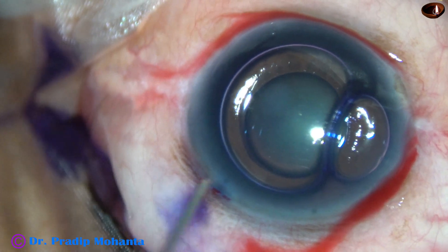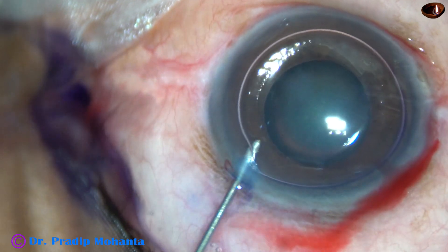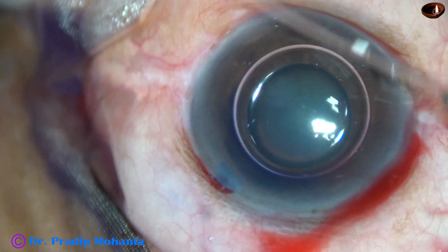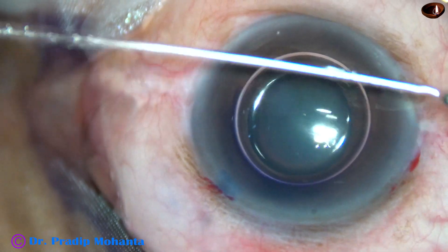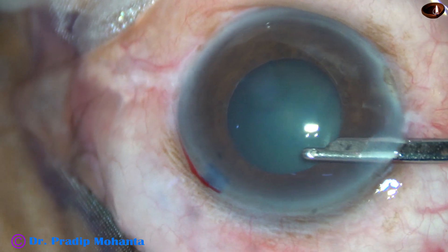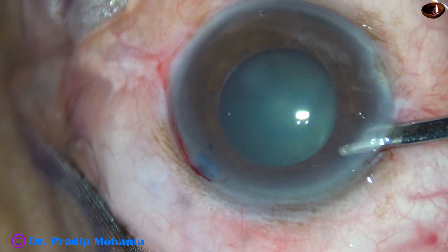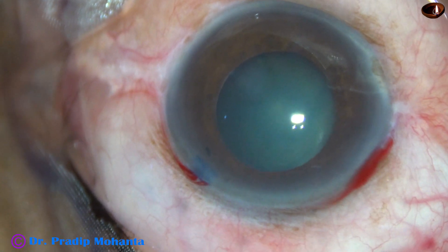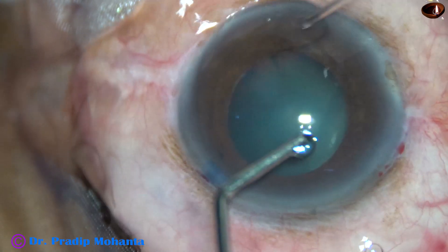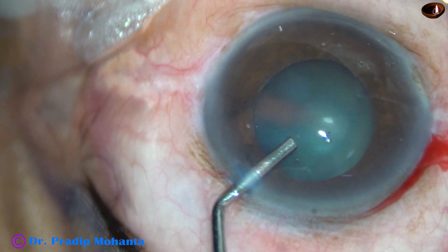In this case, I am going to use adrenaline to see if the pupil dilates a little more. Size of this pupil is about 4.5 mm, but the pupil didn't dilate — probably the size is about 5 mm. It didn't dilate with adrenaline.